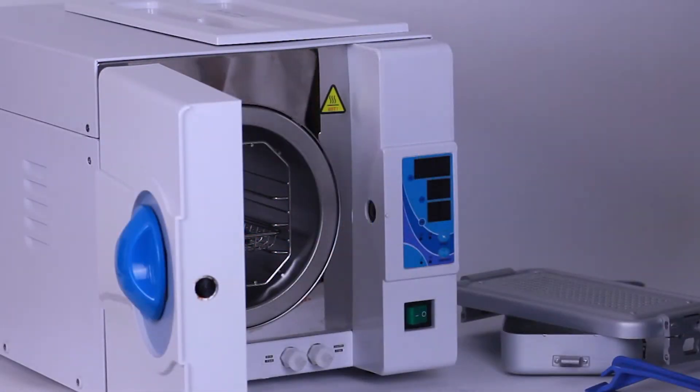If the autoclave door is opened fully before the drying cycle, cold room air will rush into the chamber, causing condensation on the instruments. This will result in water stains on the instruments and also cause wet packs.